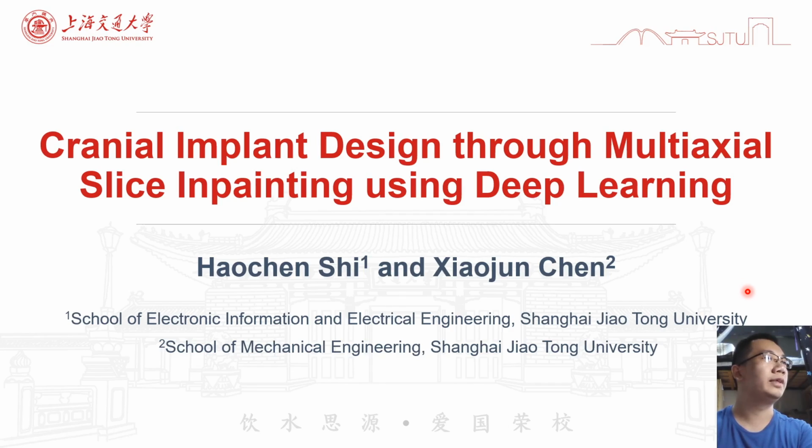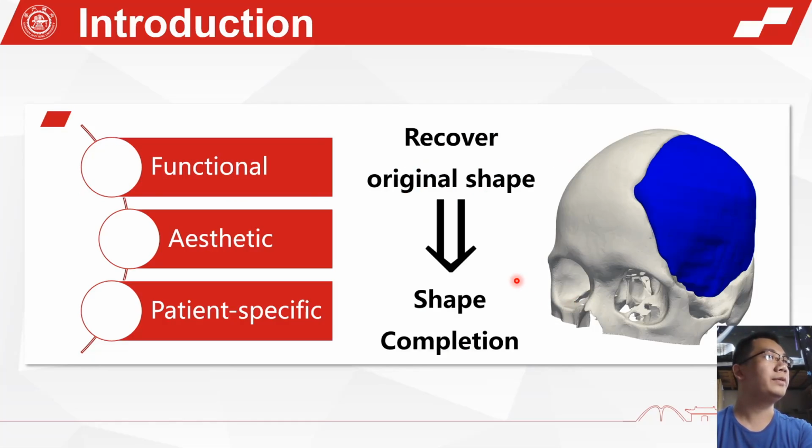Today, I'm going to present our work, Cranial Implant Design through Multiaxial Slice Inpainting using deep learning. Cranial implants are used to repair cranium defects, which may be caused by trauma or brain tumors.